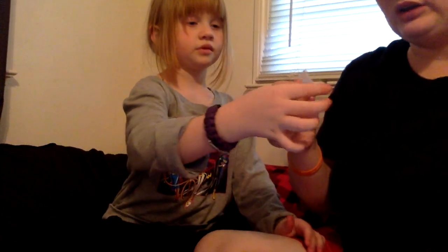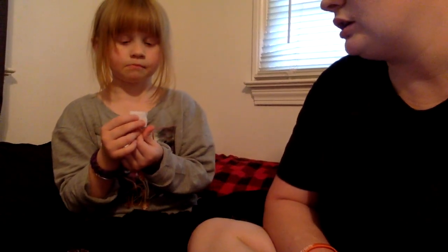Now, a lot of people don't like to use alcohol wipes if they don't have to, because it can make you get wrong readings. But we tend to use them only when we have to. But you have to make sure it dries completely. Otherwise, it can make you get, like I said, false readings. And that's one of the things you don't want, especially when you're calibrating a sensor.